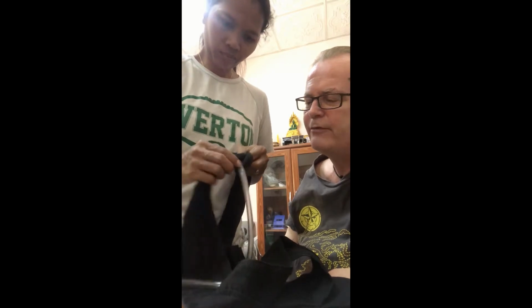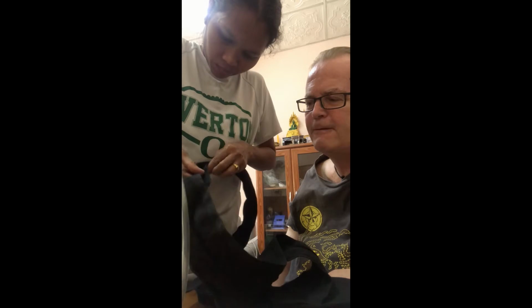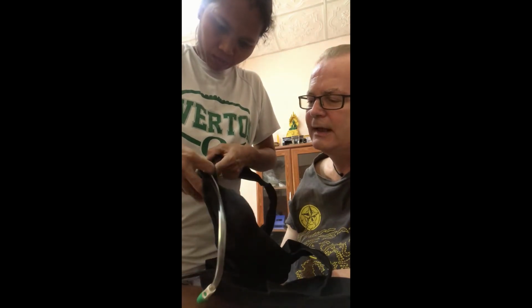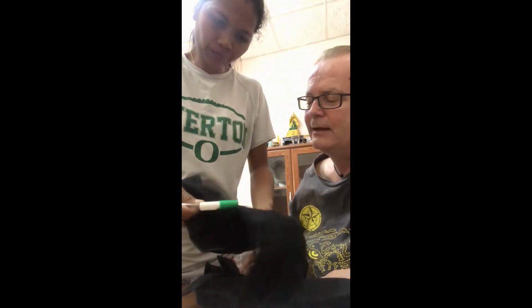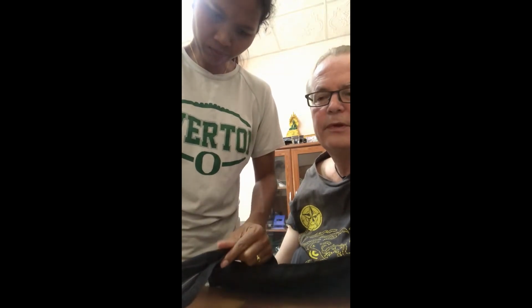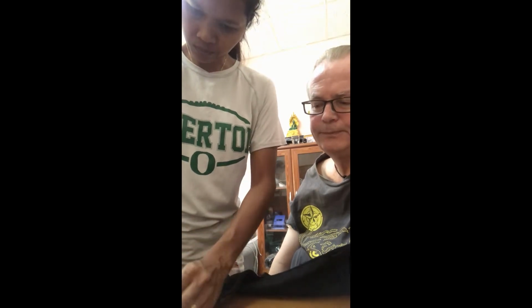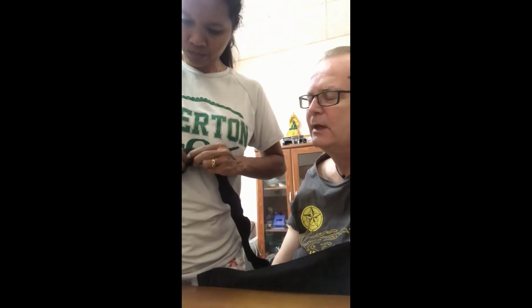You can also just take the pipe off or slide it down while you're having a shower. You don't have to take the whole thing off. So if you've got two hands, of course, you can put the pipe cover around the pipe, and then it will be ready to be attached to your catheter that is already attached to your body.